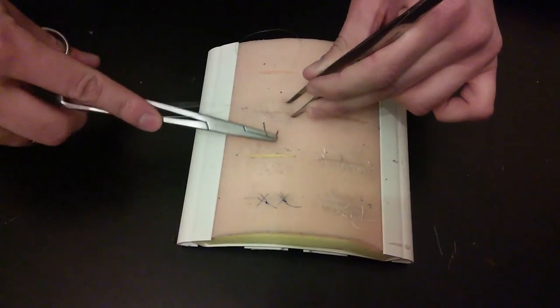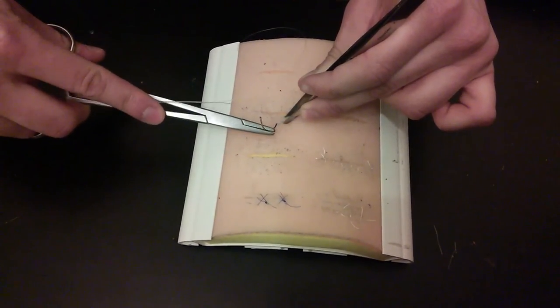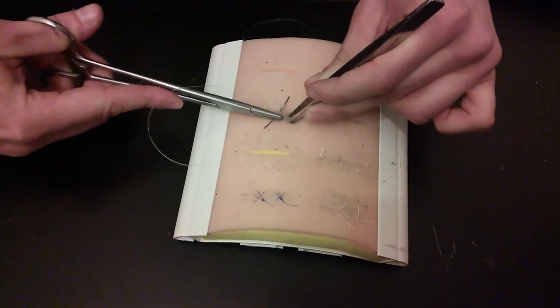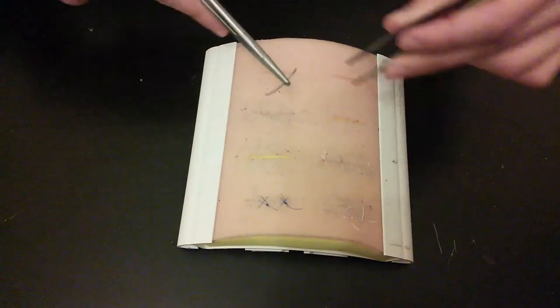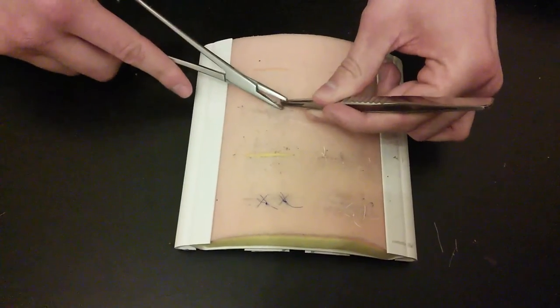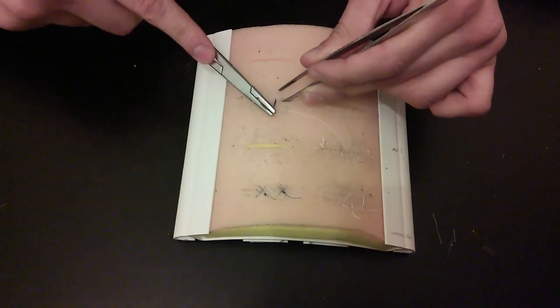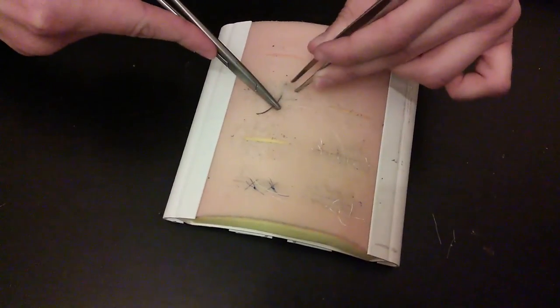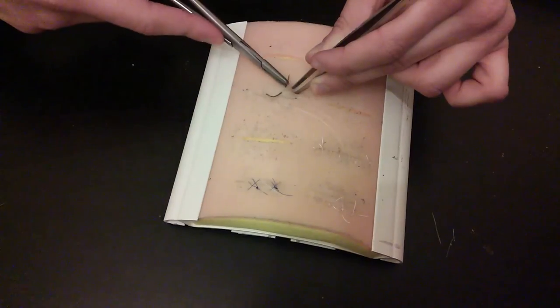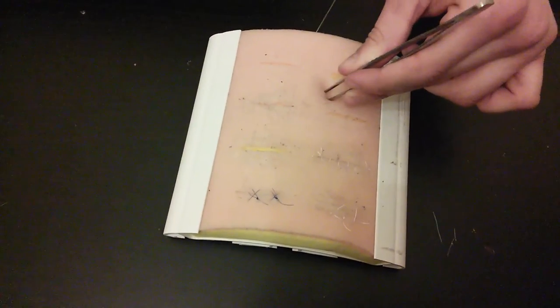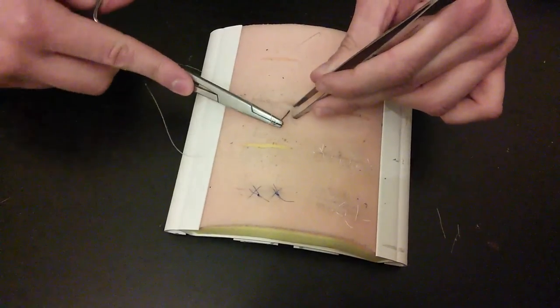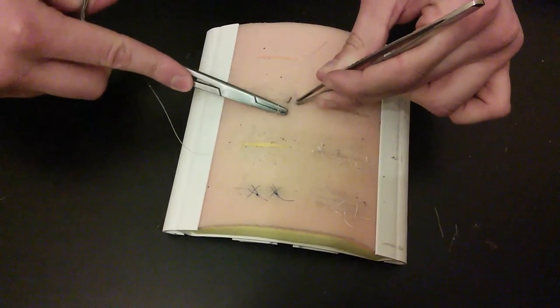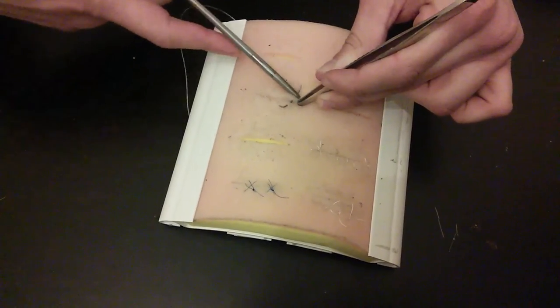Cross over again. Pull through. One more time. We'll do one more.